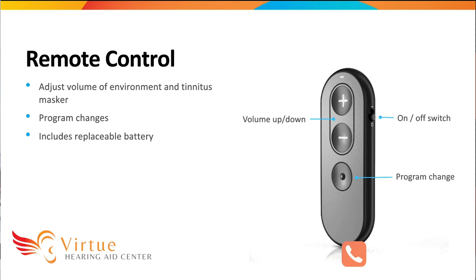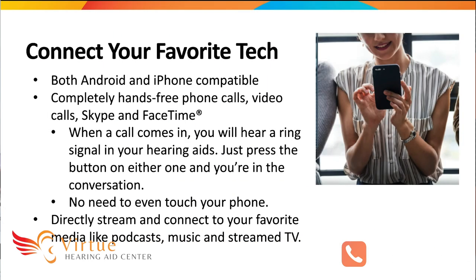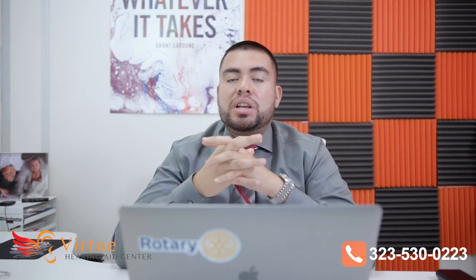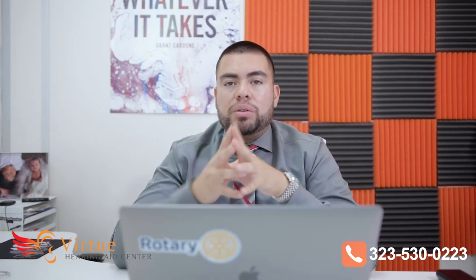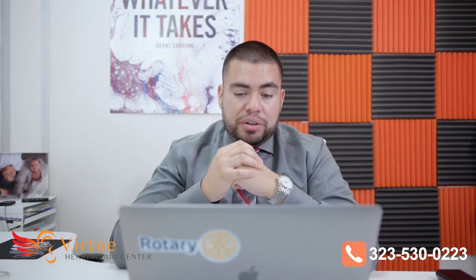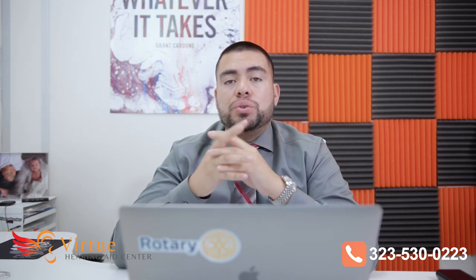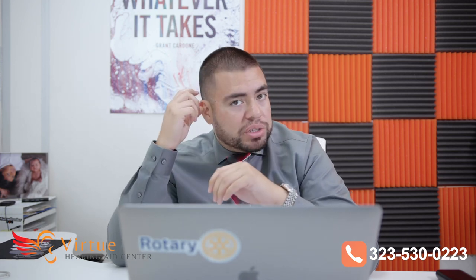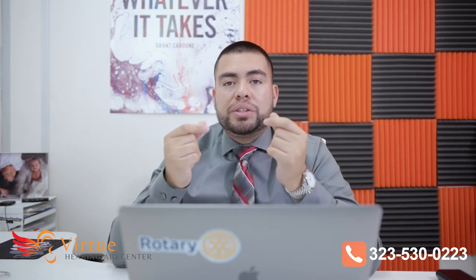The remote control is for patients who have dexterity issues and can't reach their ears to make control adjustments — it allows you to raise and lower the volume and change programs directly from your fingertips. You can connect your hearing aids to an iPhone or Android — as long as it has Bluetooth — so that you can stream phone calls, video calls, FaceTime, Zoom, music, and any audio from your phone to both of your ears. You can even answer calls without touching your phone by pressing the button on your hearing aids.